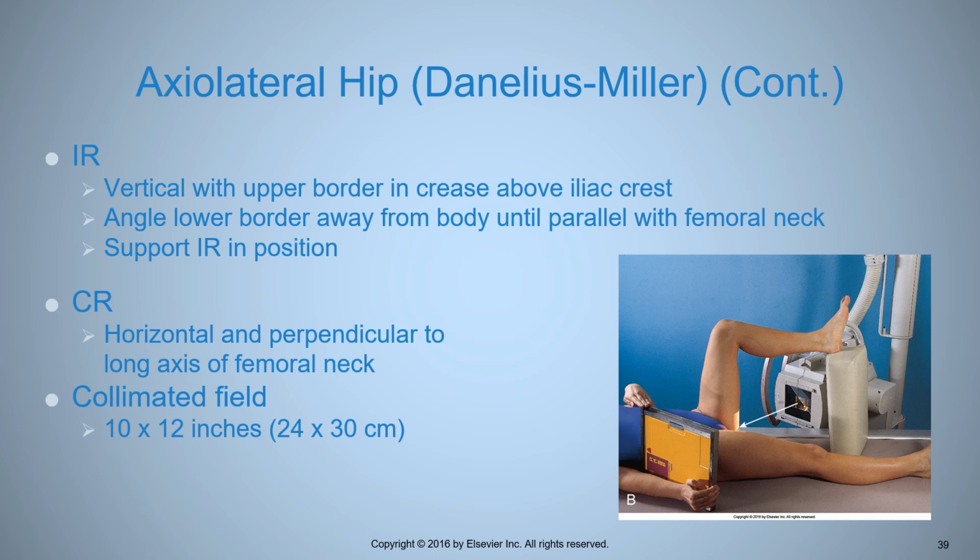If you don't have a foam sponge that tall, you can invert a trash can, one of the circular squat ones, and put a pillow on top of it for padding. Take the garbage can liner out of the trash can before you invert it. I speak from experience. Don't let them rest their foot on an uncovered trash can.